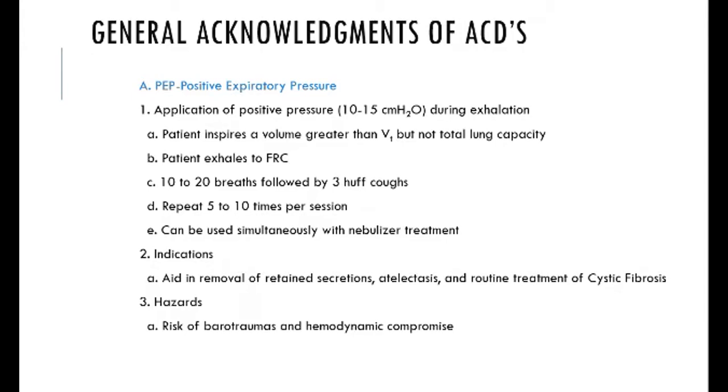I can put a breathing treatment in line with that, like the small volume nebulizer I showed you. This right here. The small volume nebulizer with the right attachments, guys, can be placed in between here. So I can put my device like that. See that?